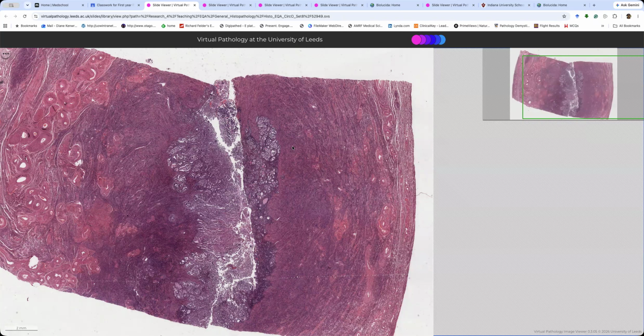But it sounds like it might be grade 1 endometrioid. So I don't like to use it. I'm sorry. It'll be in Kurt's notes, I know, but I think it's atypical hyperplasia.